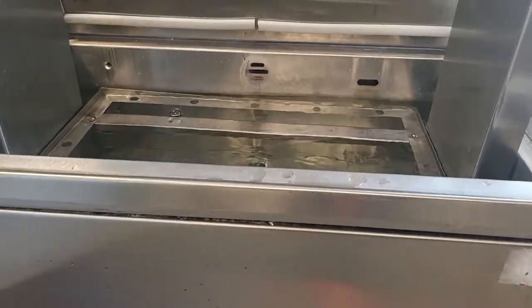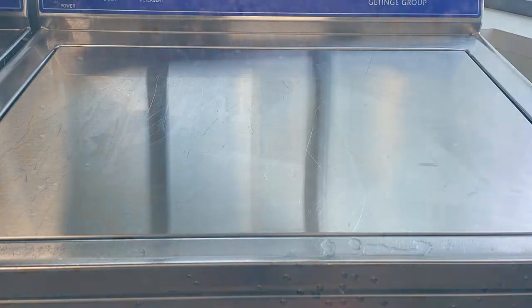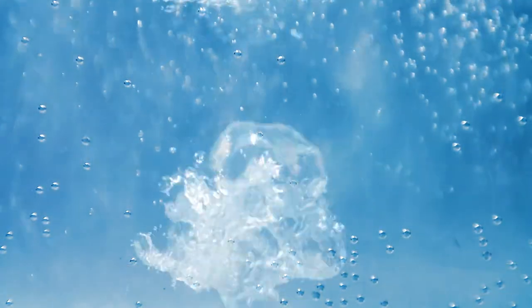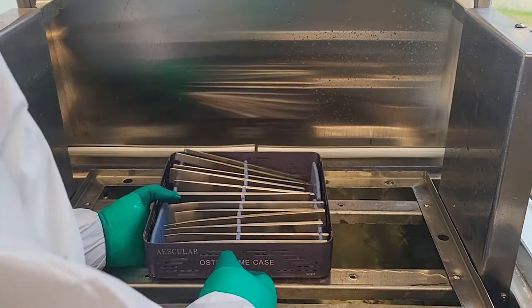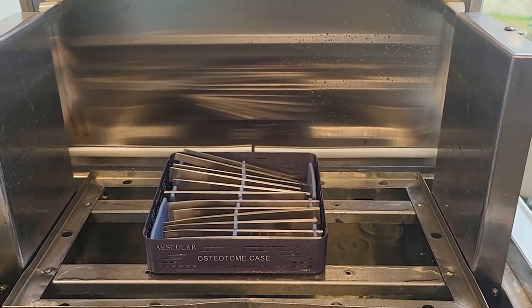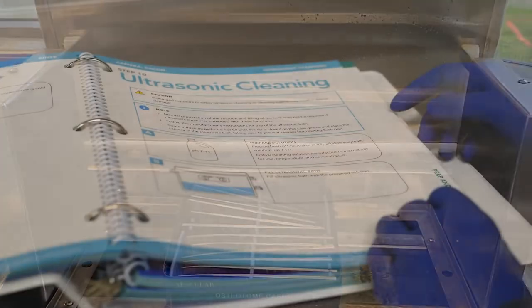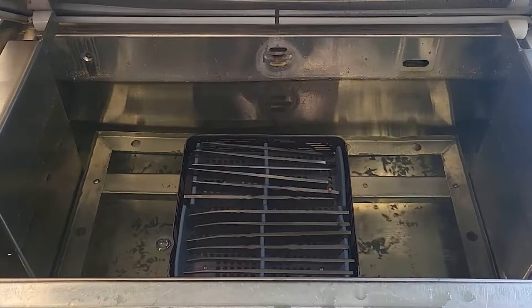An ultrasonic cleaner is vital to the cleaning process. It performs cavitation to remove remaining debris and soil by creating bubbles that implode against the instrumentation. So cool. These bubbles must be able to contact the instrumentation for effectiveness. So the SP Tech must follow the ultrasonic's IFUs as to not overfill and limit the machine's effectiveness.